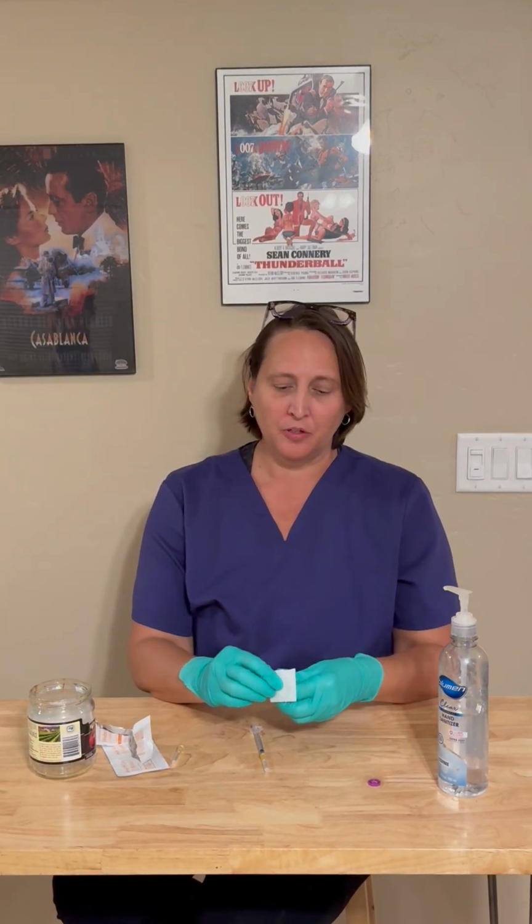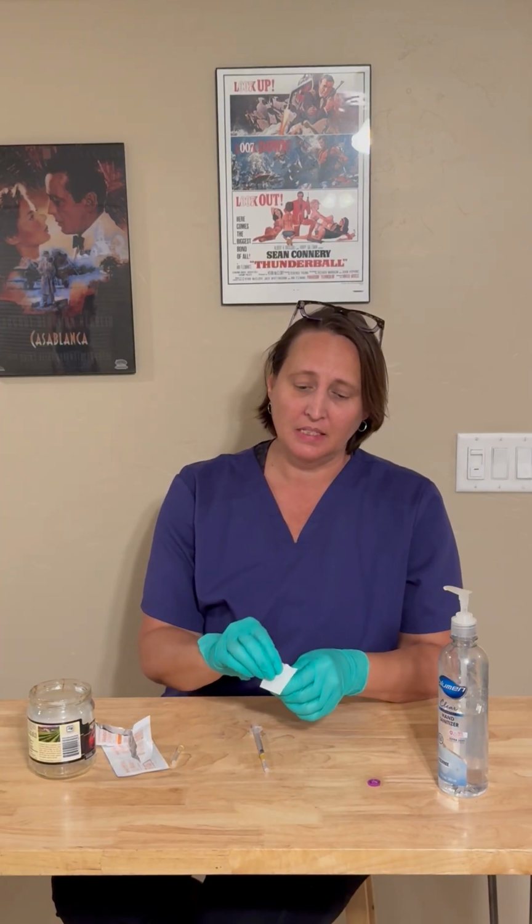You'll press down firmly, agitating the rubber stopper for about 15 to 30 seconds. While I'm doing this, I'll remind everyone to allow it to dry for 10 seconds after agitating the top. The 10-second dry time is important to allow the alcohol to kill any microbes on the stopper. All right, that was 15 seconds.